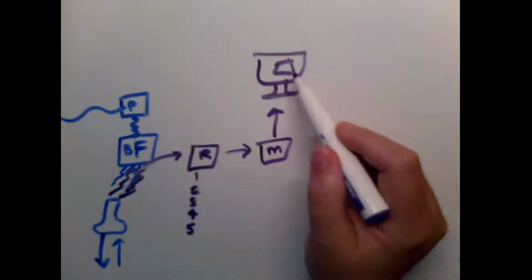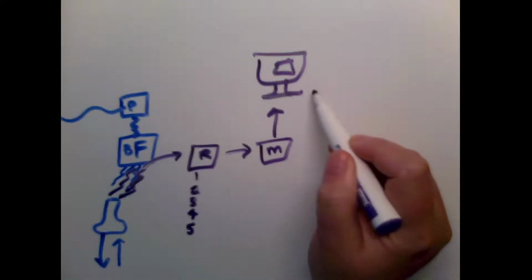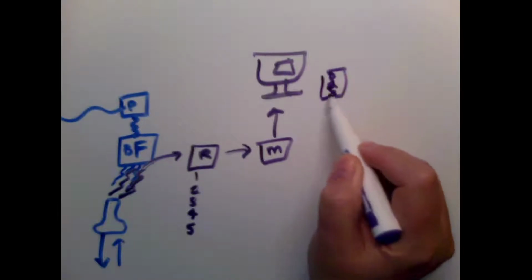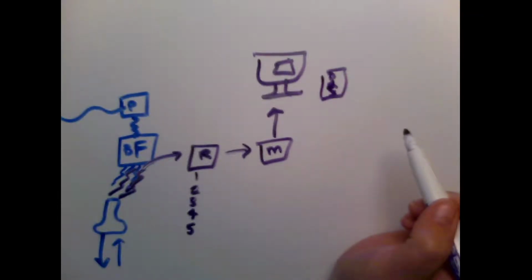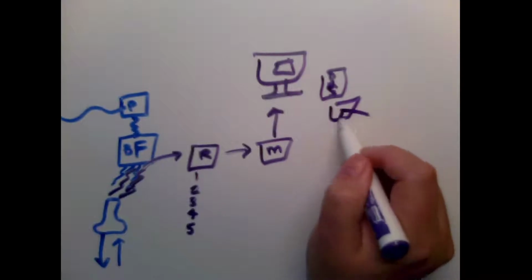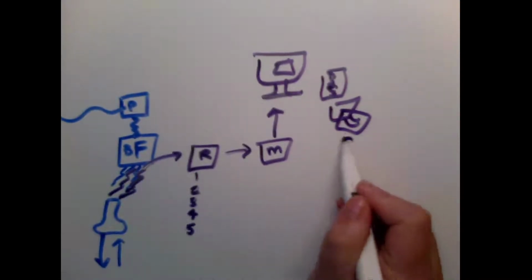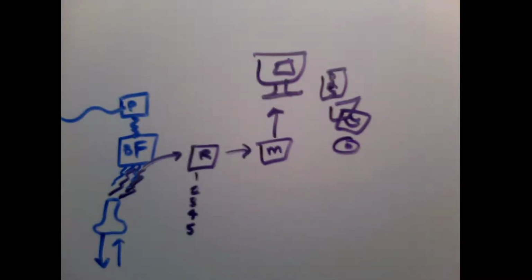So we're going to send from the display, we are either going to send it off to our PACS system, which will hold electronic images, or we can print them out on a piece of paper, or we can put them onto CDs, multiple different storage units in there.